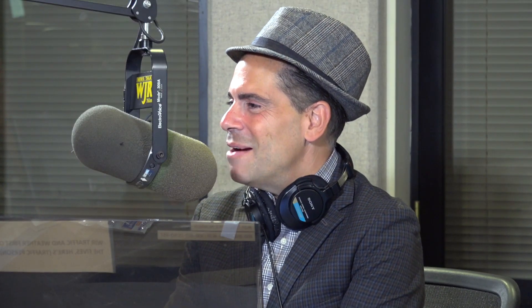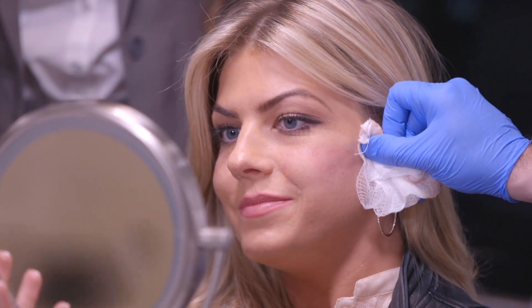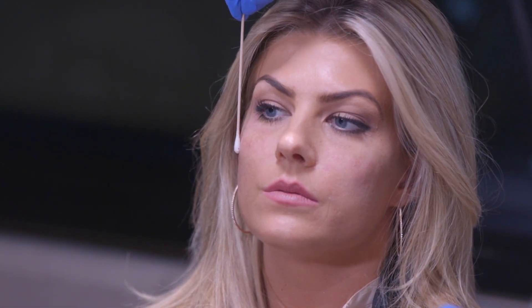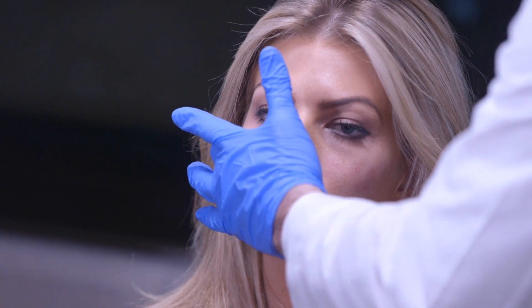An amazing procedure that just took place right here live on Facebook, and the patient gives a thumbs up — she said it looks great. Look at the curve right here: the zygomatic arch comes down, it curves, and then it continues, very subtle. If you put your finger on it you really can't feel it because it's on the bone. The goal is to look rejuvenated and refreshed. If someone were to look at her and say 'I don't know what she had done but she looks great,' we did a good job. You don't want to look augmented, you want to look rejuvenated. What we did here today is unprecedented.